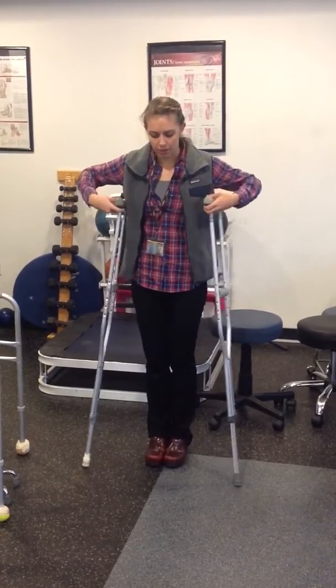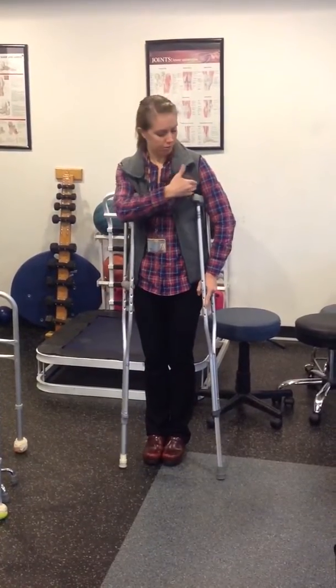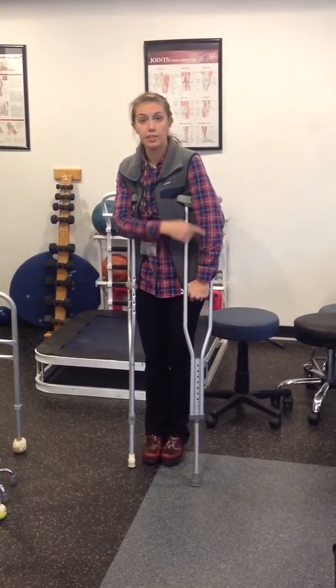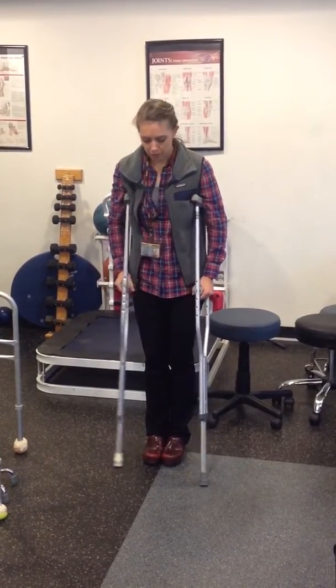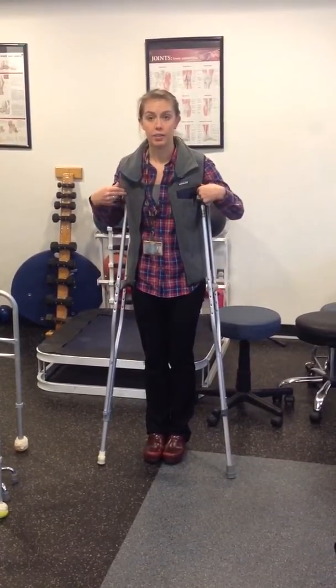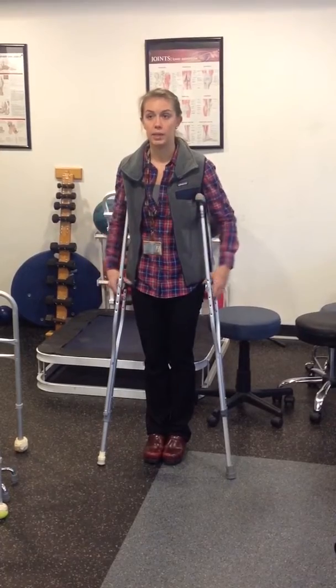With crutches, you want them to be about four fingers from your armpit, and then you want to have about a 10 to 15 degree bend in your elbow. The most important thing is that you want to be pushing through your hands and not have the top of the crutch sitting in your armpit.